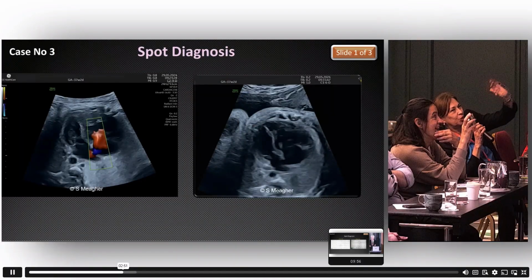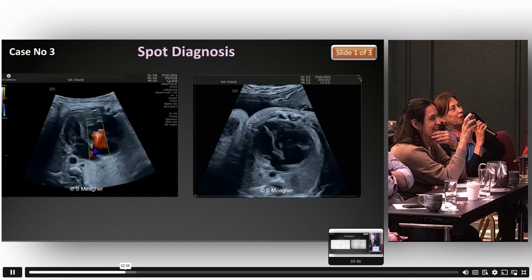Okay. First of all, I just want to correct you on something when you put the M-mode. It's not the foramen that's touching the left atrium, it's the flap valve of the foramen. The foramen is the hole, so the foramen doesn't touch the wall. It's the foramen ovale flap valve, just a correction.